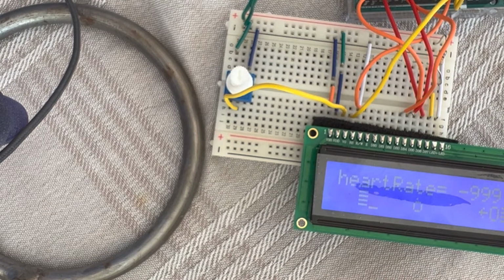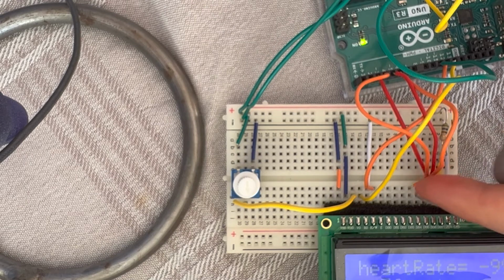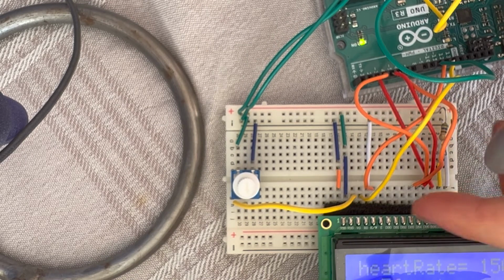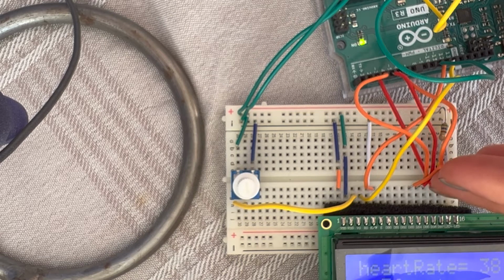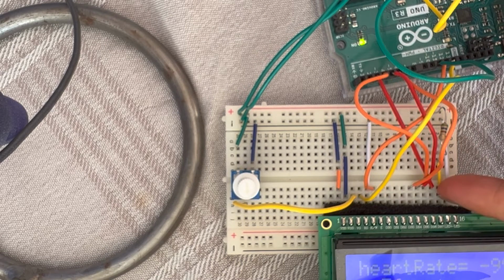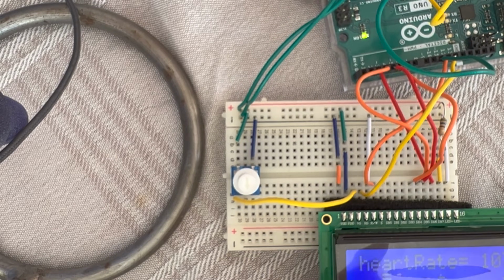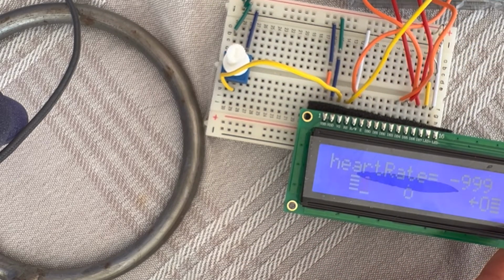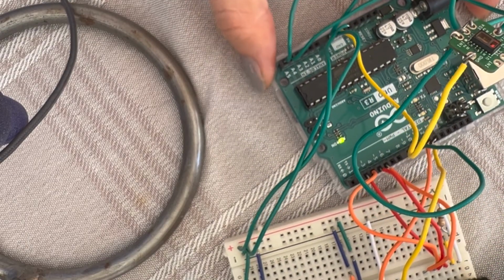In your case you will see boxes here, a bunch of boxes from here to there. If it's completely blank, make sure that you have connected the pins right. These are the opposite sides. So D4 is connected to 5, and then D7 is connected to 2. Don't mix that up, because we tend to connect them in order, but that doesn't work. They should be in the opposite order. Yeah, this is the connection part. After running the code, we will see how it works. Let's check.